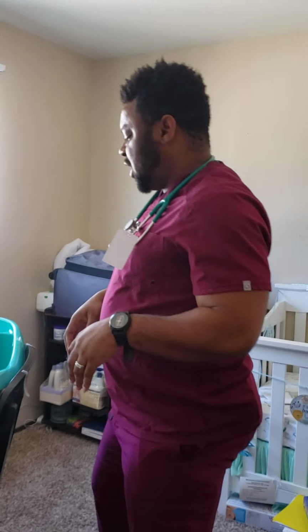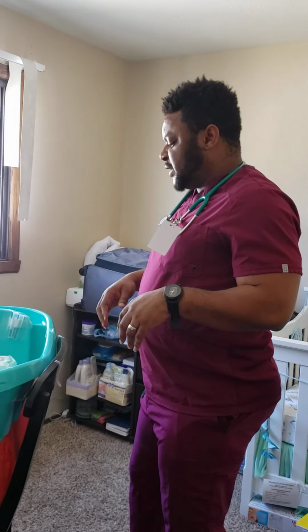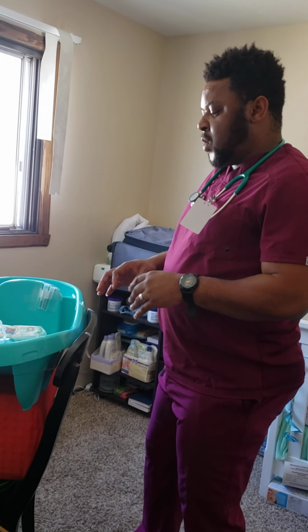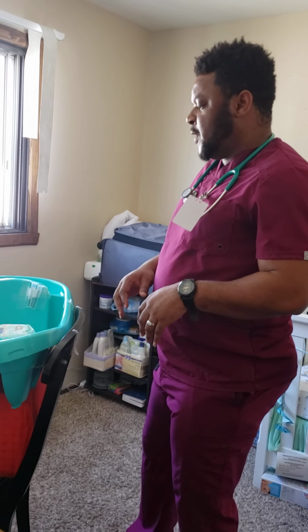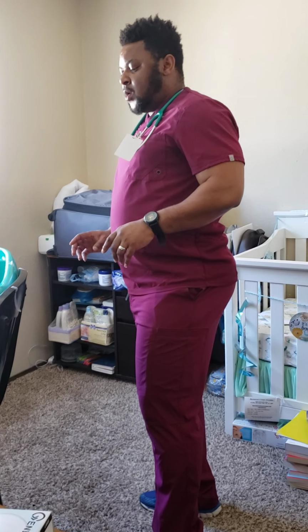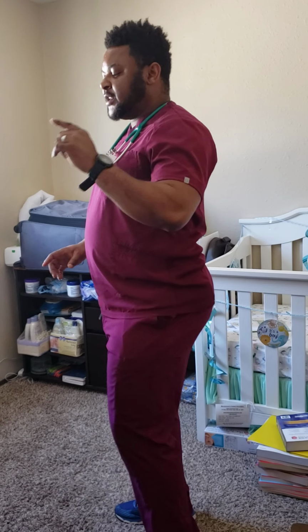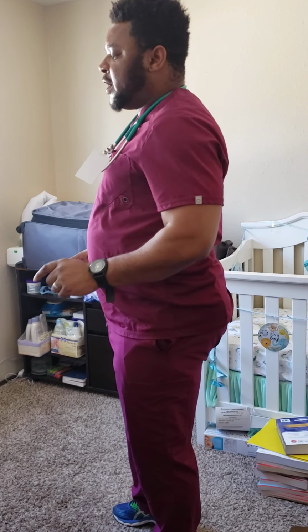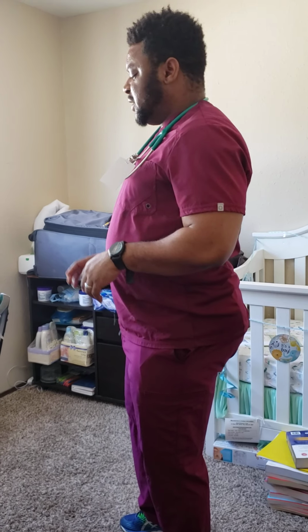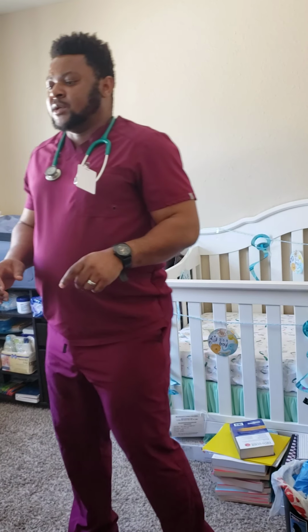After I reassess my patient, I check for bowel sounds, check for tenderness, check for any inconvenience or how they tolerated the process. Then I will go ahead and chart, bring down the patient's bed to a comfortable position and give them their call light. Then after 30 minutes, I'll come back and reassess the patient, whether they can tolerate water, ice, or any liquid that has been prescribed for them, to see if they tolerated it. Then I do all my charting. I think that's it for nasogastric tube discontinuation.